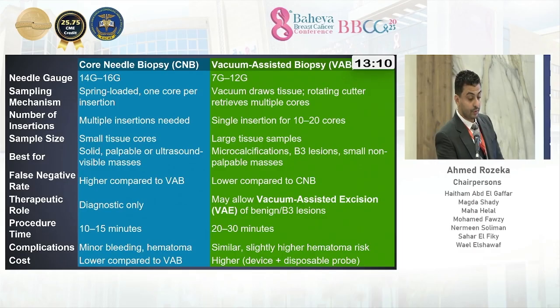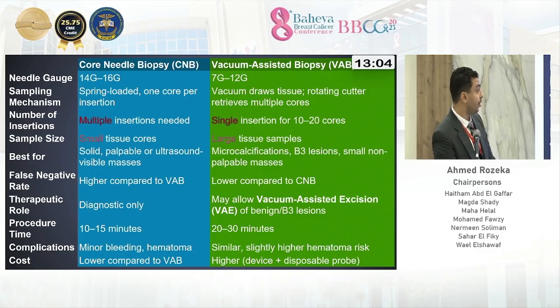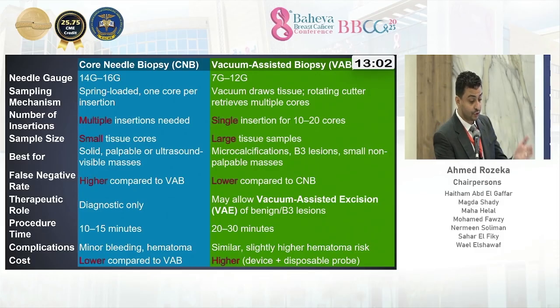This is a real quick table. It's a big table, but just to highlight the important parts between the core needle biopsy and the vacuum. The core needle biopsy, we have to insert the needle multiple times, while the vacuum, we insert it only once. So like I said, 360 rotation. The sample size in the core biopsy is much smaller than the vacuum. The false negative rate in the core needle biopsy is much higher compared to the vacuum, but obviously the vacuum is much more expensive.